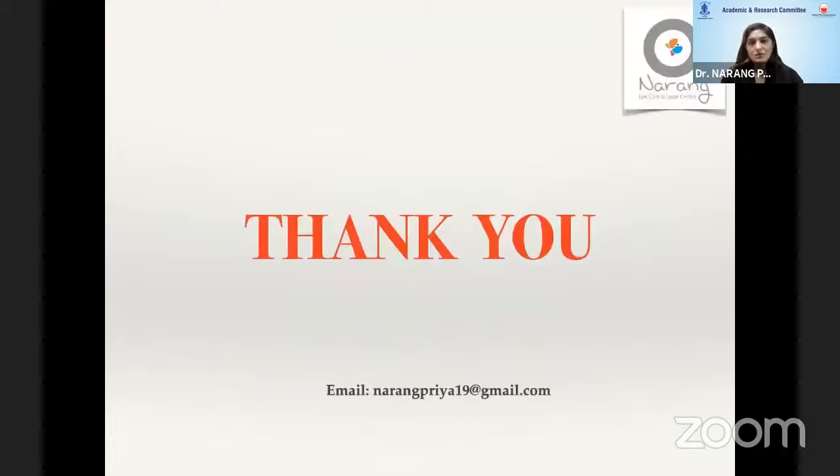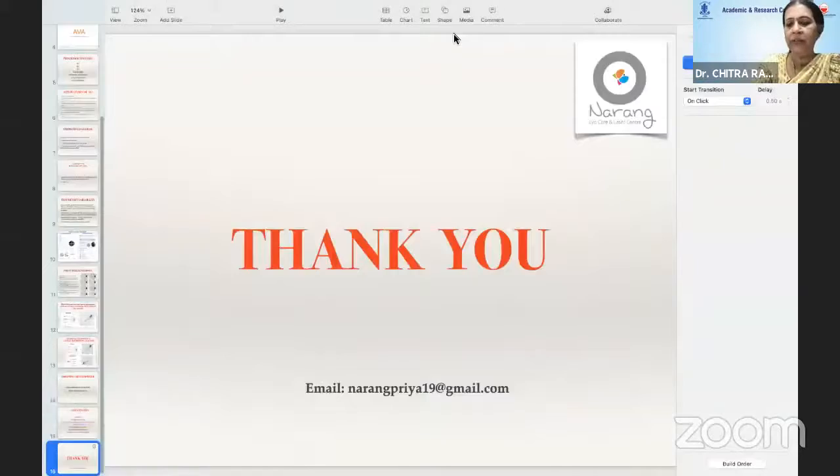Thank you so much, Dr. Priya, for giving us all the salient features here. There's also one advantage: you can wear your own glasses, so you do not have the rim defects which can occur when you're using a trial frame.